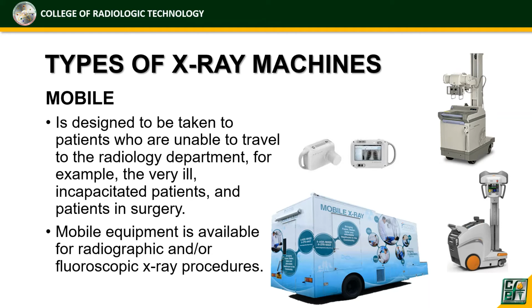Example, if the patient is critically ill in the ER or in the intensive care units, as well as in the operating room before or even after the operation. So these are the examples of the X-ray mobile unit.